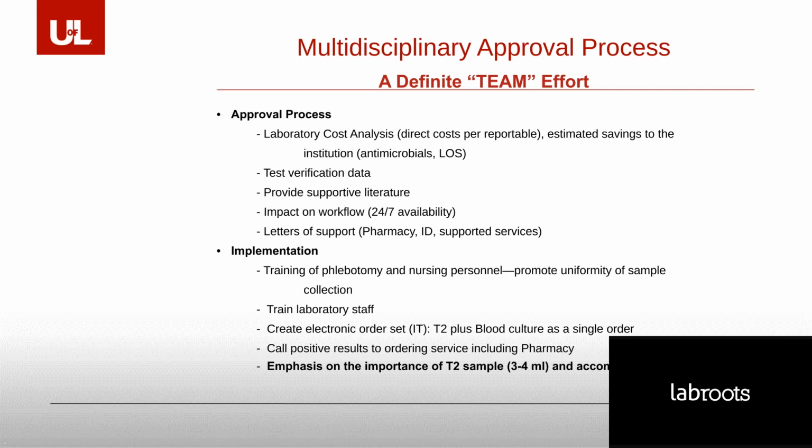It started with the training of the phlebotomy team, of which the company was very good in terms of their support. They also trained the nursing personnel. And I should inform you, we are a network-based core laboratory. We serve 8 facilities in our region, 4 of which are hospitals. And once again, these people have been trained. We're waiting to train 1 more hospital that just came aboard in the last year. But the goal was to promote uniformity of the sample collection.